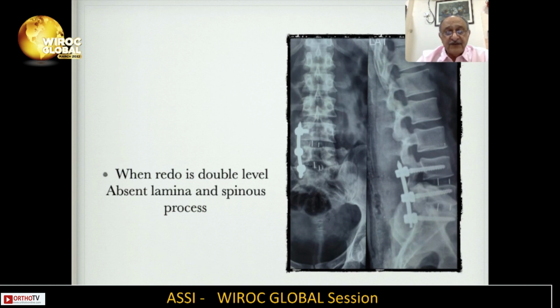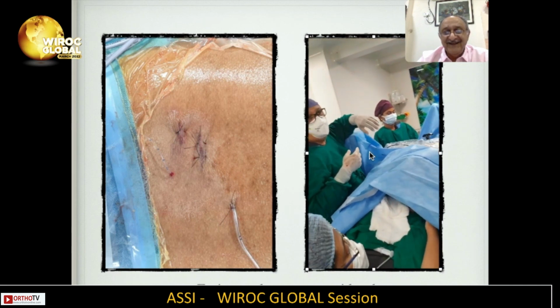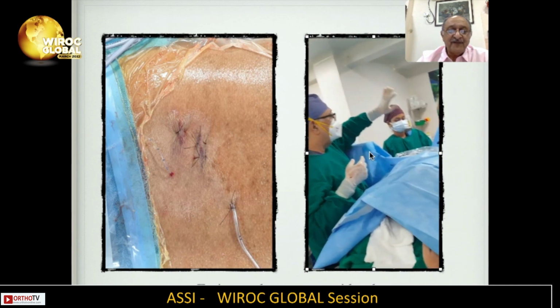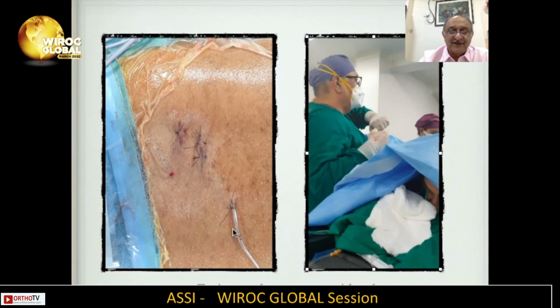This is a case of a redo surgery where previous laminectomy has been done, severe collapse, claudication, pain, and we needed to decompress, elevate height, and do a fixation. Here you see a wonderful scar on the back of a patient who's undergone UBE TLIF, and this particular case is of an elderly gentleman, and you can see the patient moving his legs. The entire surgery has been done under a sensory epidural block, and our patient is nice and awake throughout the surgery. And there you see him nice and awake. So I hope you enjoy that.